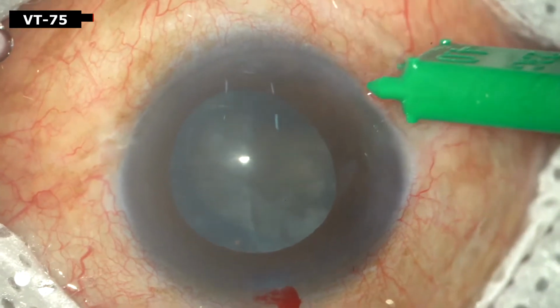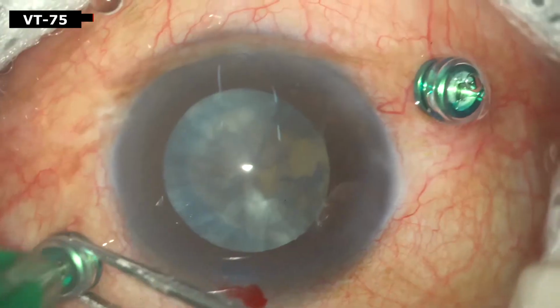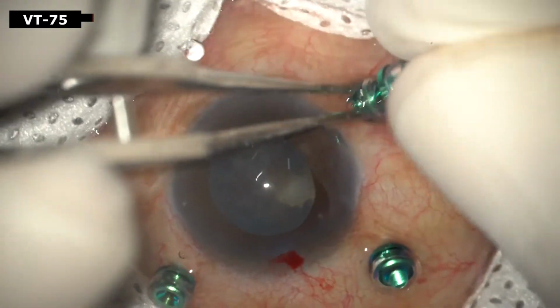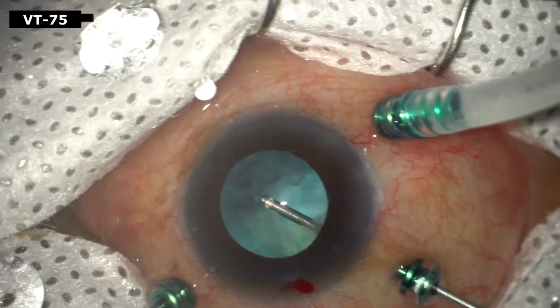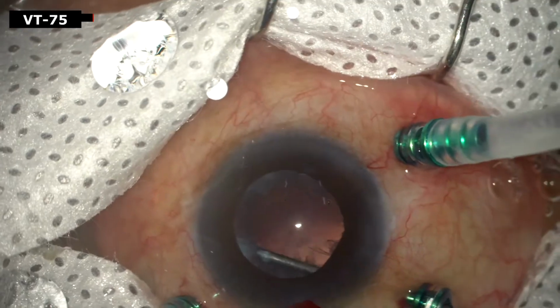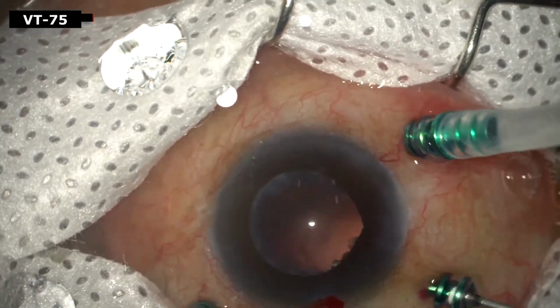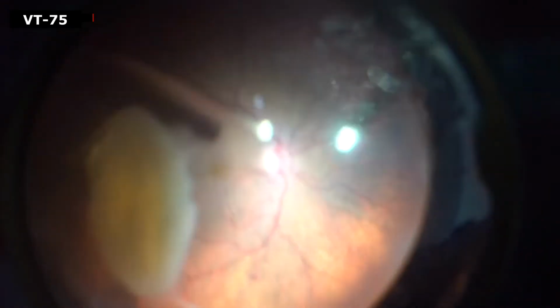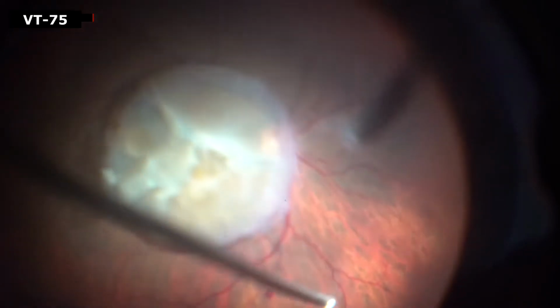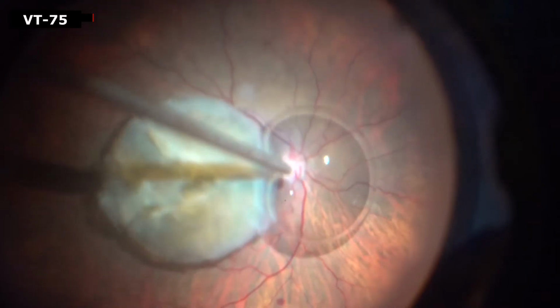Now coming to the management of the cases, 3 port 23 gauge sclerotomies were done. The cortex was cleared. Vitrectomy was started. PVD was induced. PFCL was injected over the posterior pole to protect the macula.